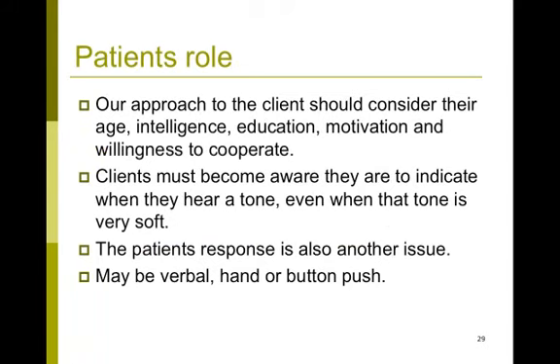Of course, an important factor that affects our test results would be the patient himself. So our approach to the patient should consider their age, their intelligence, their educational background, their motivation for this particular hearing evaluation, and their overall willingness to cooperate. Much of these details you'd be able to gather from experience and from your initial interview during the case history process.